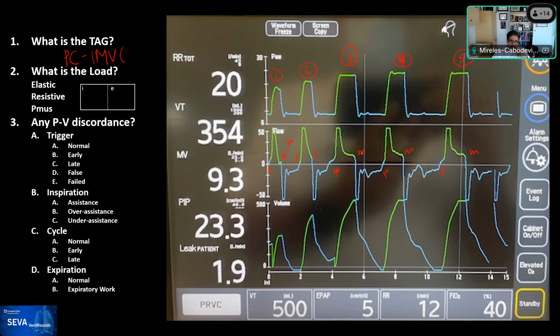This ventilator doesn't indicate pressure or flow triggering like other ventilators do, right? No, I think the changing color, the green, may mean that it's patient triggered. I'm not entirely sure, and if anybody knows, please put it in the chat. That looks more like green is inspiratory time and blue is expiratory time. It's expiratory. Yeah, makes sense. Well, I disagree, Ariel. This patient has a flow trigger on this ventilator. I'll show you in a second.